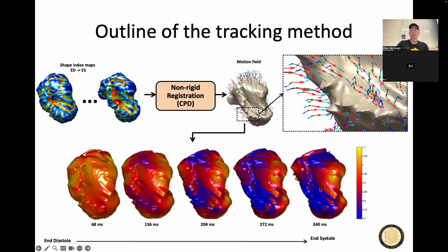And then this spot on the myocardium, on the heart wall, the reason it's blue is because the surface had to get crushed down into a smaller space. So those points, in order to do the matching, had to crush together, and that's an indication that the heart is contracting at that point. At this point, you've got a yellow value here, which means it's actually stretched compared to what it was over here. It's supposed to be contracting between here and this time, but this blob of tissue is not contracting, it's getting stretched. So it's abnormal, right?